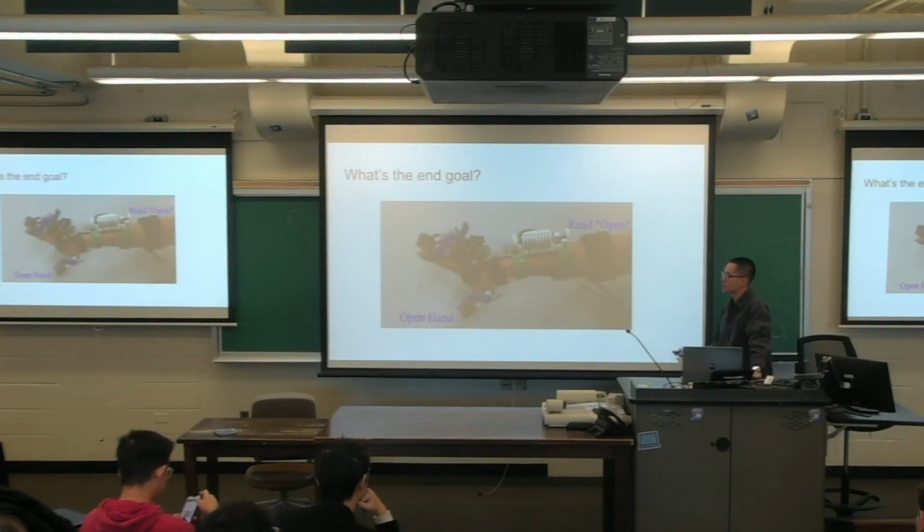So this is the goal. This is what we want to do. We want to do inference using the EMG signals with machine learning. Cool.